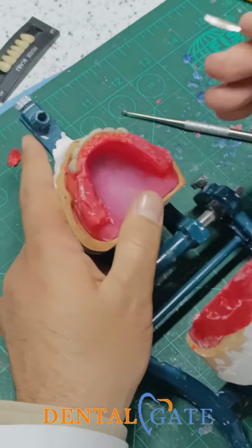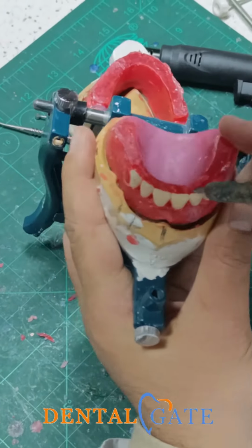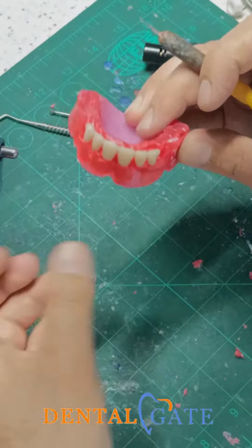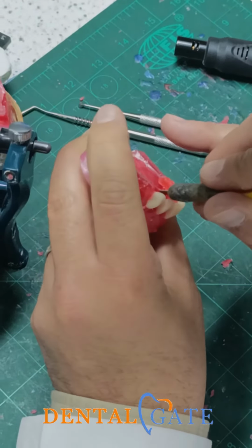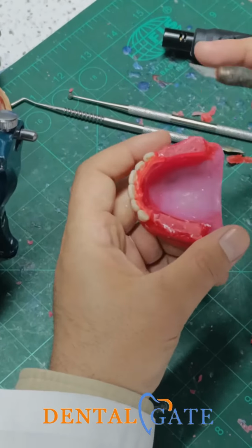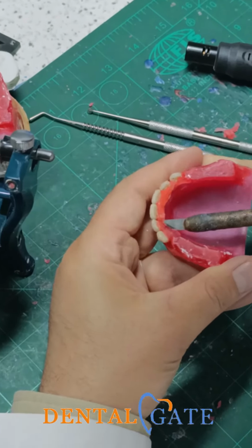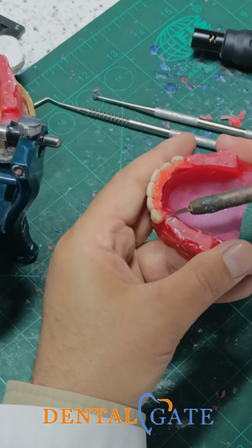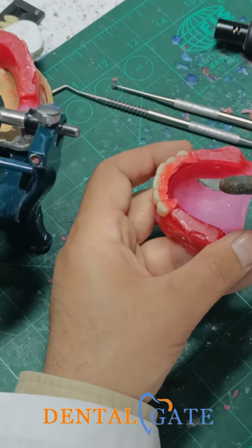But before that, remove the excess of wax from here, because I don't need this wax in the lingual aspect, because I need to make overjet and overlapping here. So remove the excess of wax. Consequently, we will make a carving here in the further stage, okay?